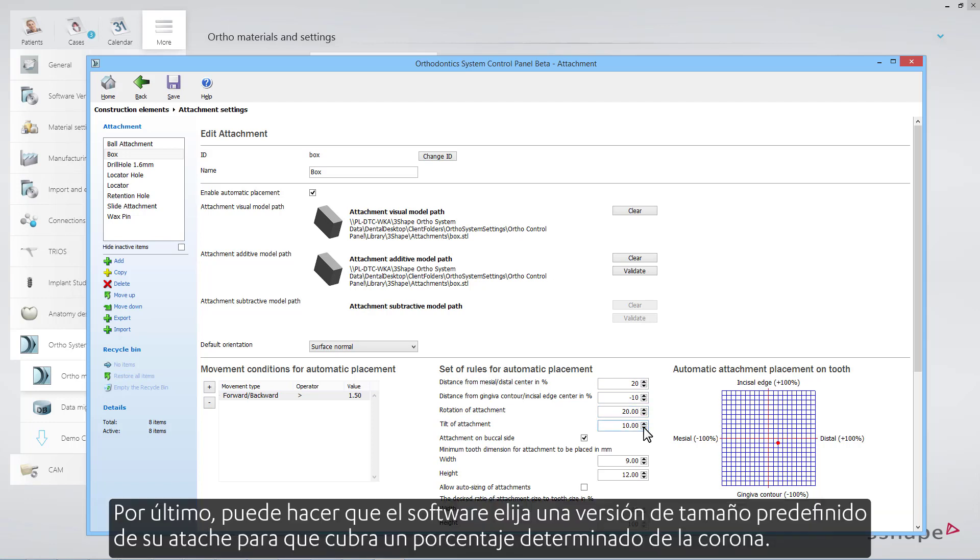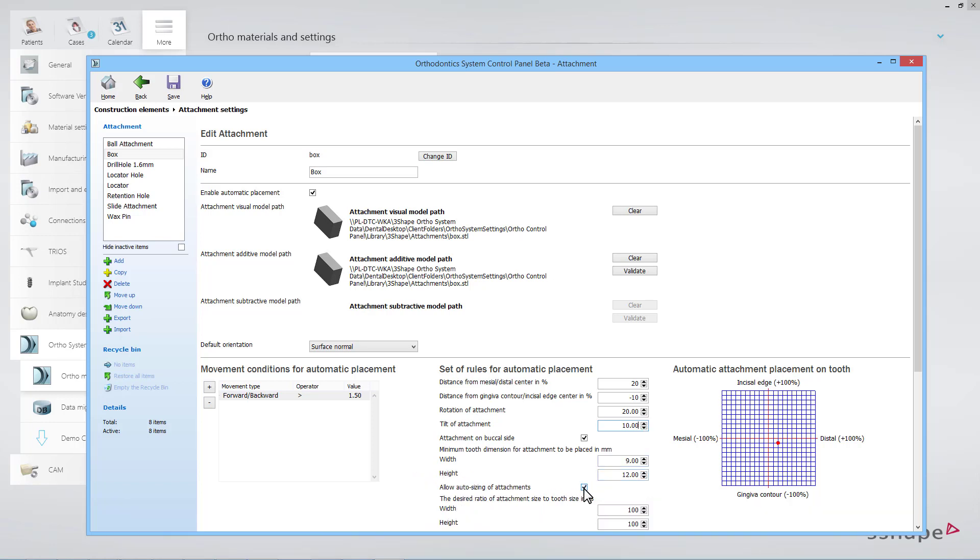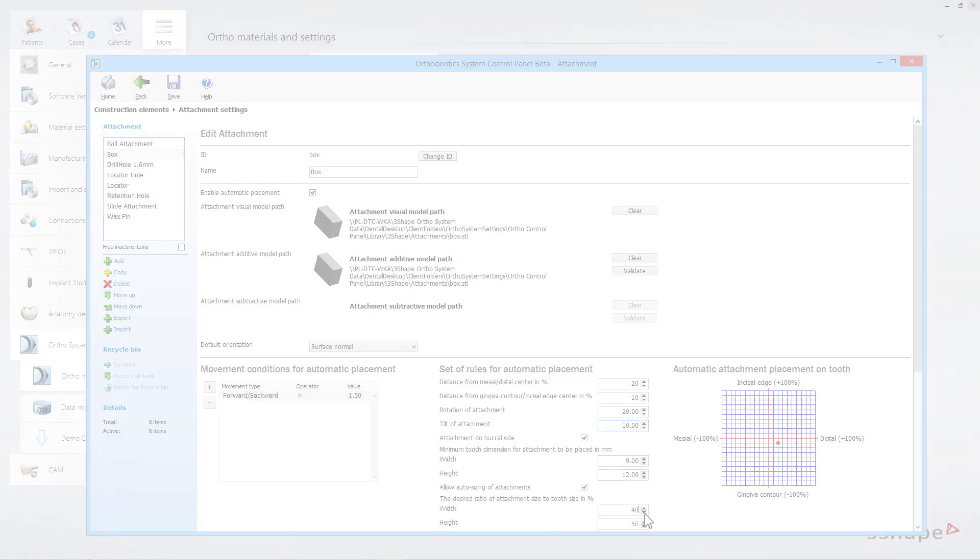Finally, you can have the software choose a pre-sized version of your attachment, so that it will cover a given percentage of the crown. For instance, if you want it to cover up to 50% of the height and 40% of the width, you can set the values by using the arrow buttons to the right.